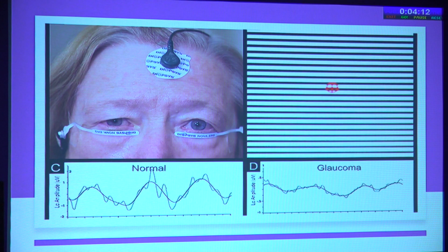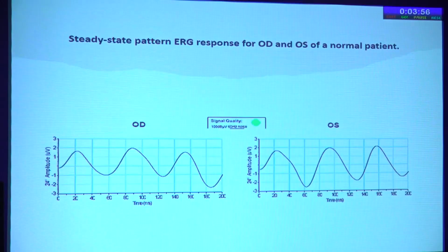So you should have a gel that gives you perfect contact. Two, the skin should be dry. Three, the skin should not be too lax and loose. That also gives a problem. So in very old individuals or saggy skin, we have a big issue. But it can be overcome by meticulous application of electrodes. So you have this kind of pattern ERG response.